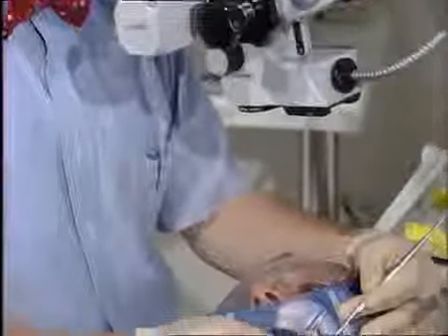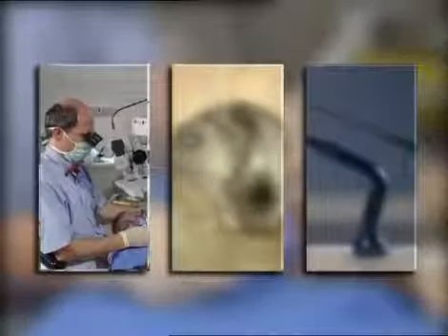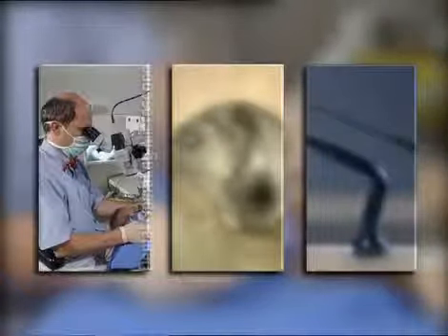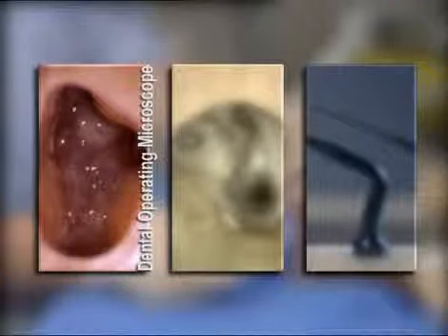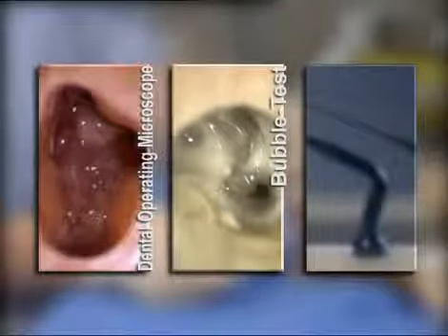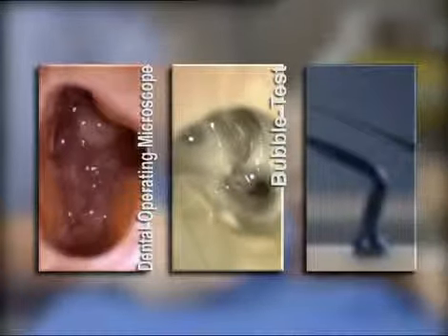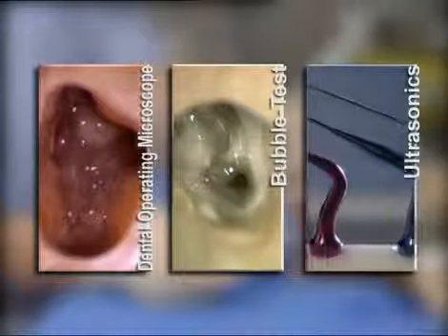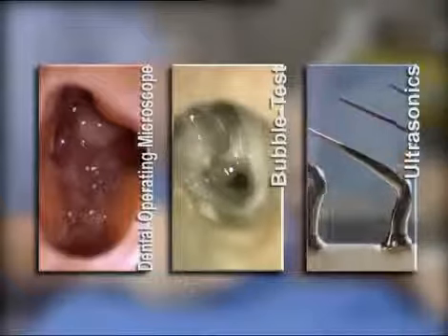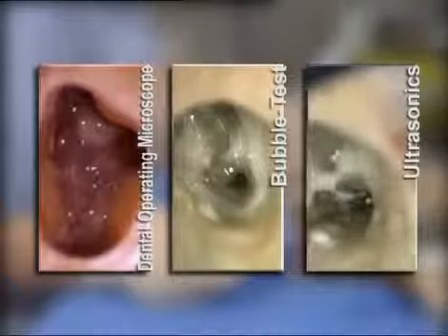In case of difficult to localize MB2 systems, different techniques can be used. The operating microscope to better visualize the anatomic footprints, such as the developmental grooves. They display different color and translucency than the surrounding dentin. The champagne test with sodium hypochlorite. Sodium hypochlorite sets off oxygen in contact with pulpal tissue of non-instrumented canals. The use of specifically designed ultrasonic tips. They allow the removal of restricted tooth structure with optimal visual control and very high precision.